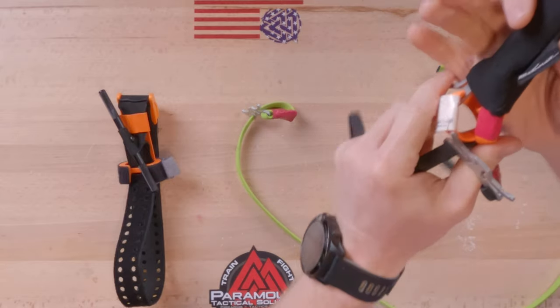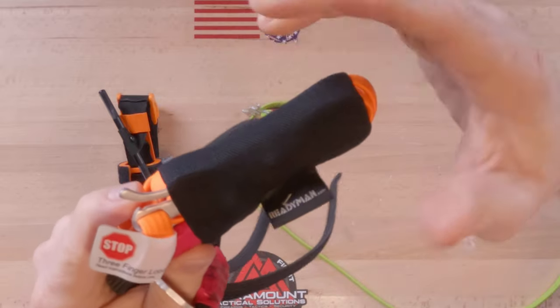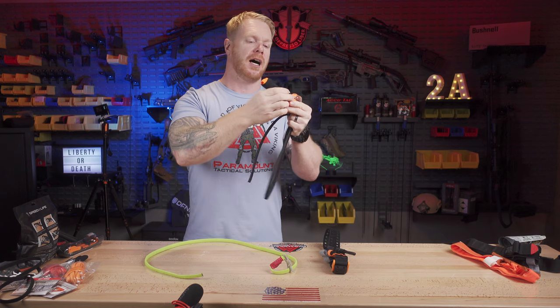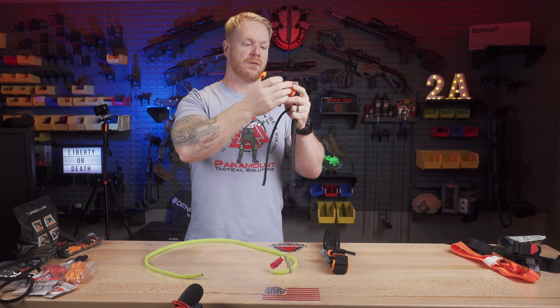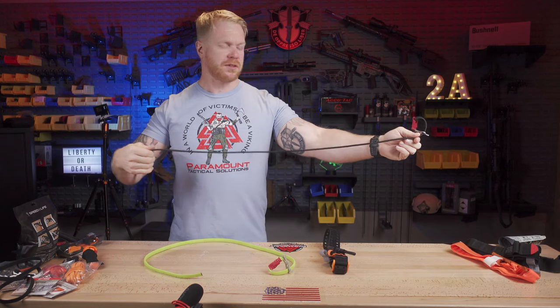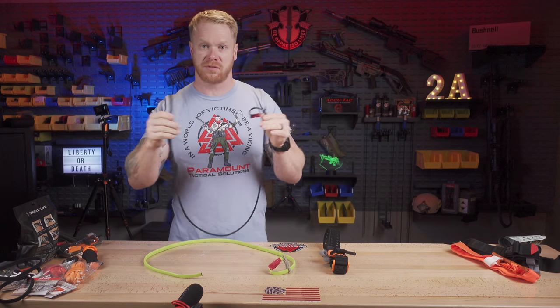On our website we also have sleeves that make it much easier to carry — it keeps it nice and compact so you can throw it into a pocket, a purse, a backpack, or whatever. So those are nice to have. Overall, it's a very simple device, which is one of the reasons why it's so simple to use.